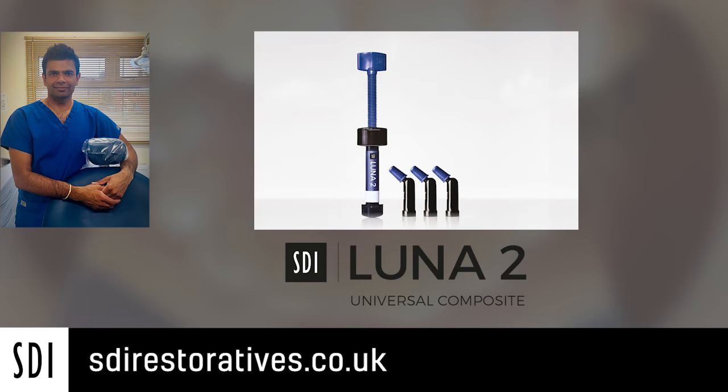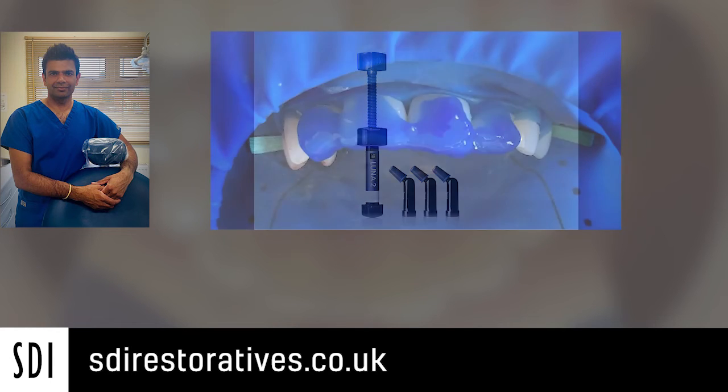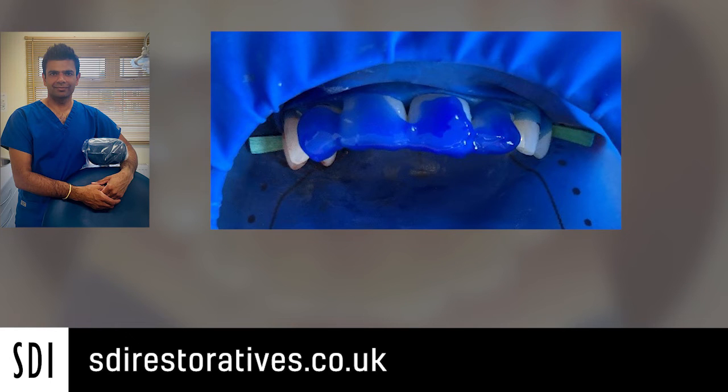This patient had previously had some tooth whitening carried out and the bleach shade was the correct shade for this patient. We isolated the teeth using a generic rubber dam system and placed the palatal putty representation of the teeth, and we can see the amount of build-up that we were required to make.